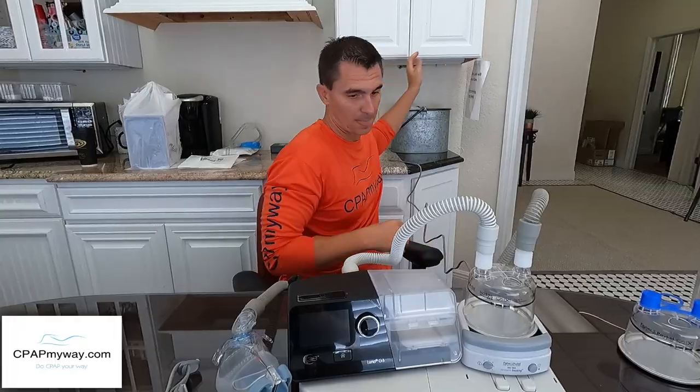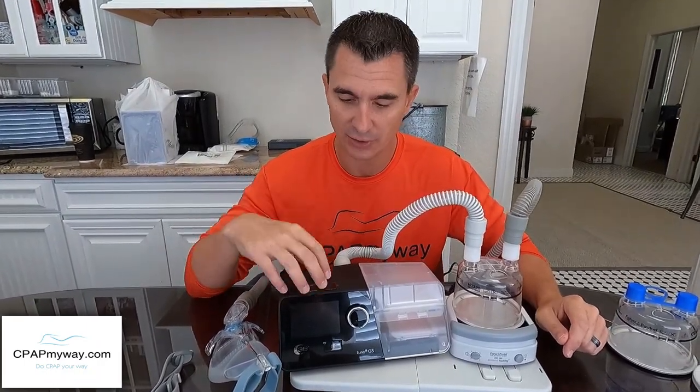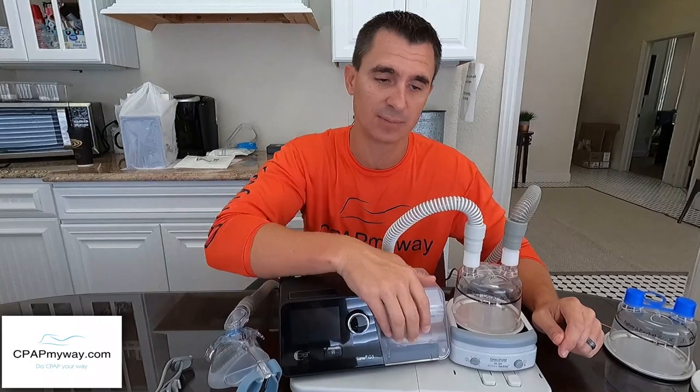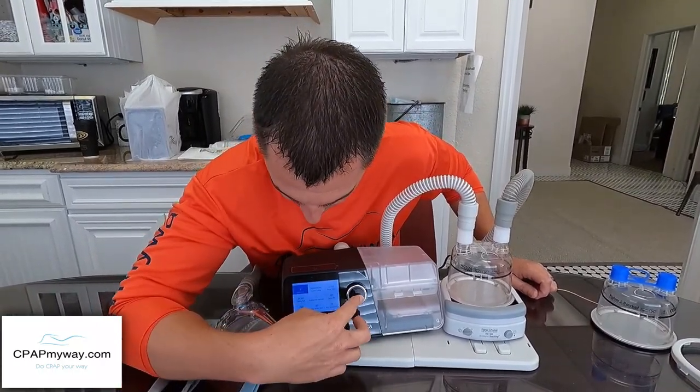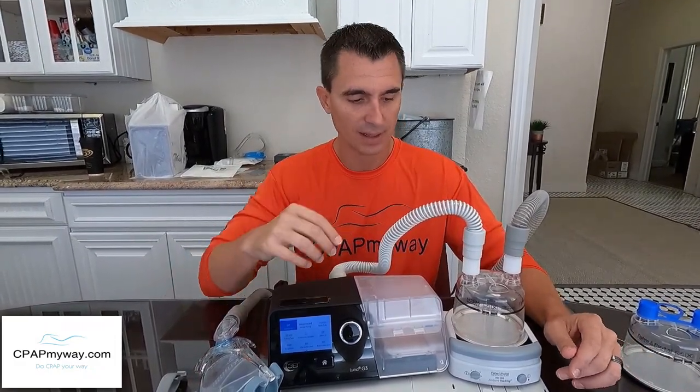One important note: the HC-150 is externally powered — it has its own plug. The way I recommend starting is to turn off the humidifier on your CPAP machine. The integrated humidifier should be set to zero and left empty — take your water chamber out, empty it. In the CPAP menu, turn the humidifier setting all the way to off. Do this on your AirSense 11, AirSense 10, DreamStation, whatever you've got — empty the chamber and turn the humidifier off, just to start.